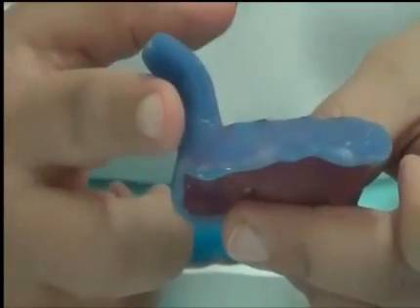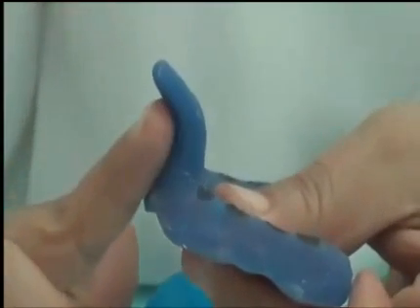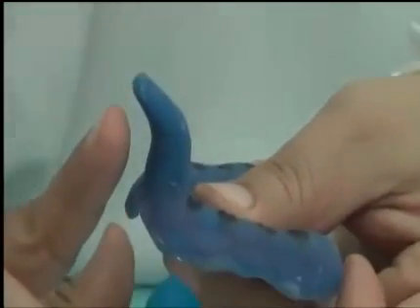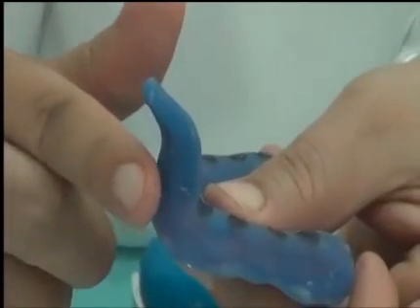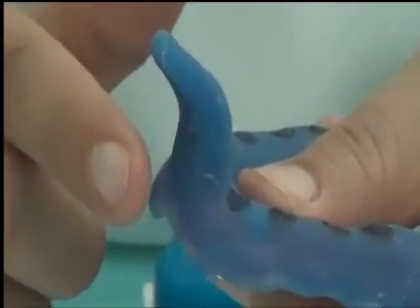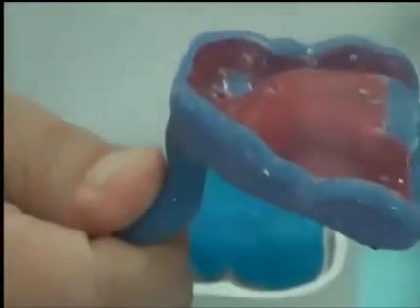We also need to make sure that the handle can accommodate the lip without distortion. If my handle is going to the outside, it will interfere with the lip of the patient. So we need to make sure the handle is clear from the lip by making the first part of it vertical, and then we rotate it to the outside just to make enough of a grip while holding it and taking the impression.